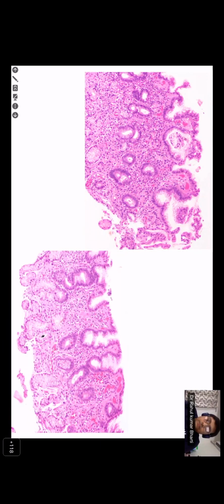Okay, Dr. Jayesh, who else would like to comment on that? Yeah, mucus secreting glands. Okay. Mucus secreting glands. So, okay, so these are actually pale mucus secreting glands. These are antral glands. Okay, so who started off? Was it Jayashree? Yes, ma'am. What will you comment at this magnification?